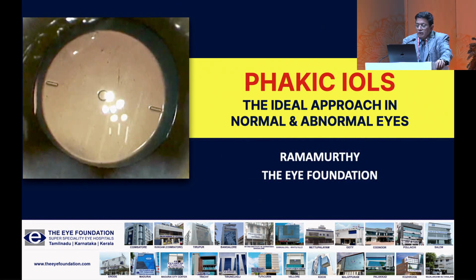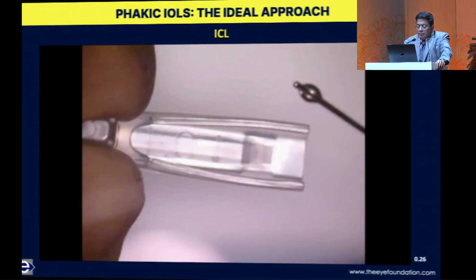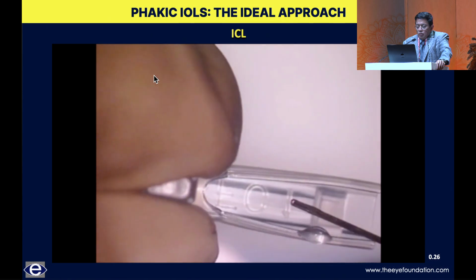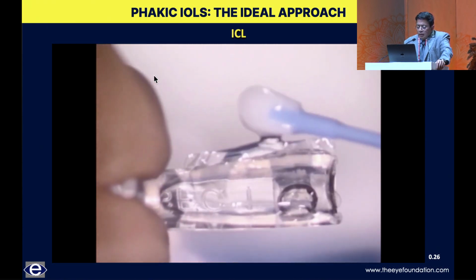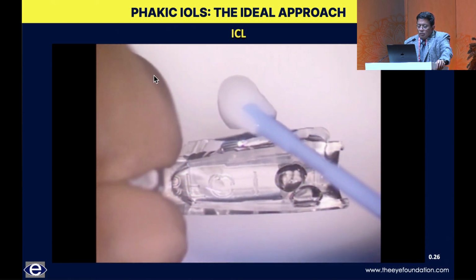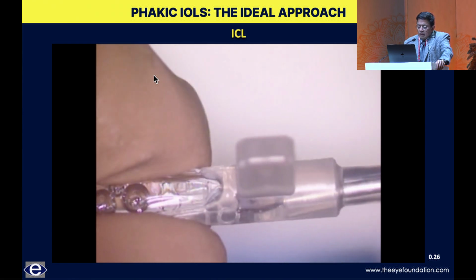A very good afternoon. I'll be covering phakic IOLs, the ideal approach in normal and abnormal eyes. It will be largely a video-based course. Phakic IOL implantation, most of you must have done this, and loading of the lens, especially with the ICLs, is the most important thing that you need to learn. The lens is dispensed nowadays in balanced salt solution, so there is no enlargement of the lens. It's taken out of the small bottle of water in which it comes and then placed in the cartridge.